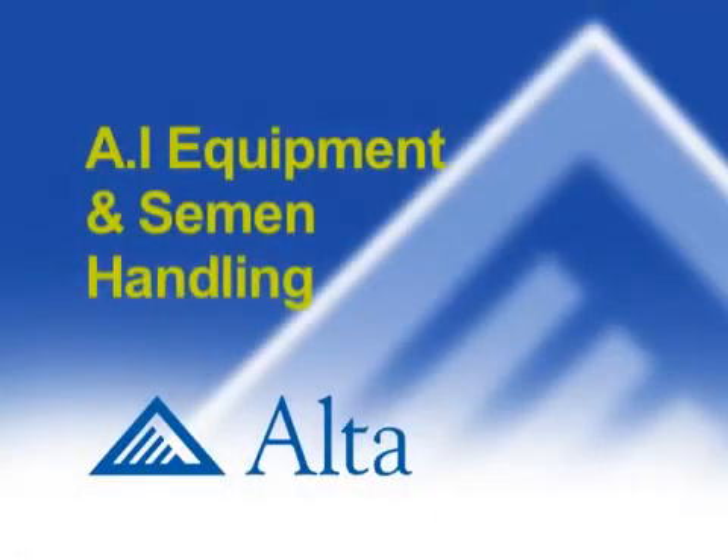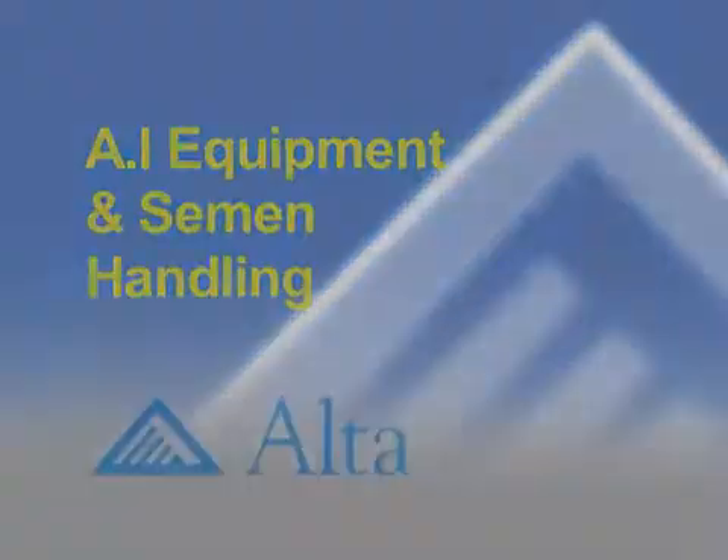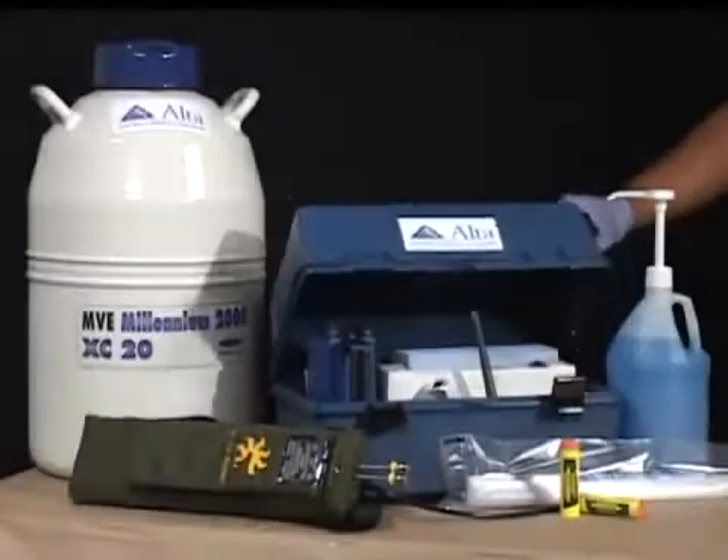Tools of the trade. We will now show the equipment needed for the artificial insemination process.